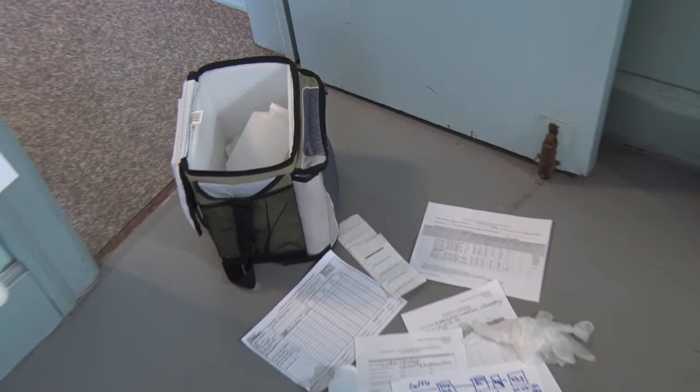Occasionally, compare the chain of custody to the sample containers in your cooler to verify that everything is accounted for. Also make sure the sample location ID codes on the labels of the bottles match the sample location ID codes on the chain of custody.